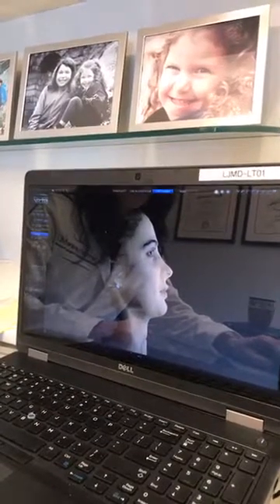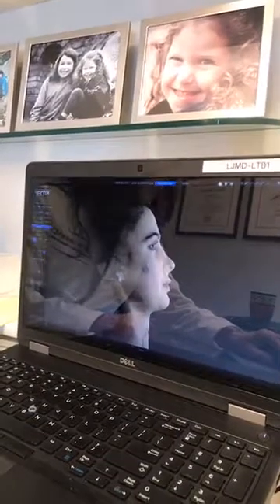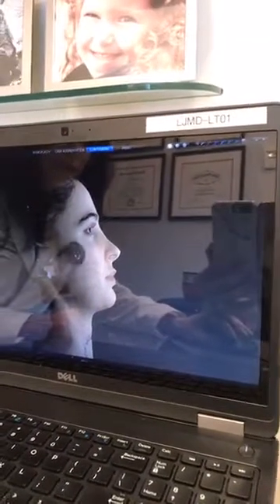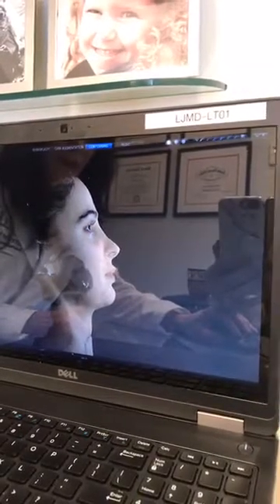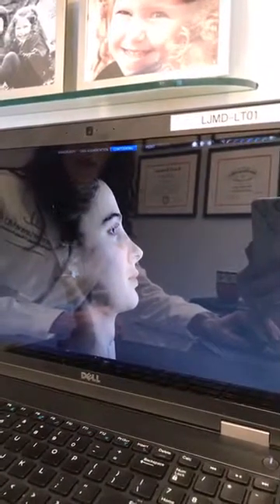One of the features that I like to use the most is something called resurface, because I want everyone's skin to be flawless and beautiful. So I could take an area and click on it, and then we could show how it would look if it was resurfaced. So that shows you what the skin would look like, smoother. Kristen doesn't have any wrinkles, but it also has the ability to erase wrinkles.